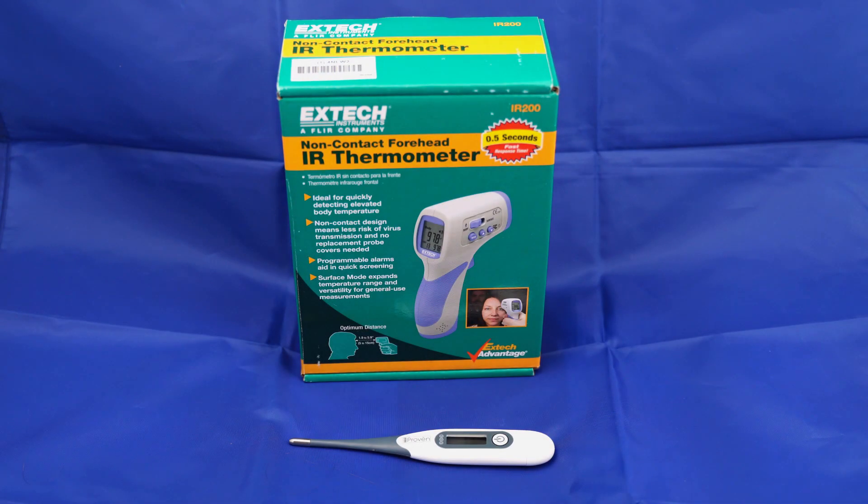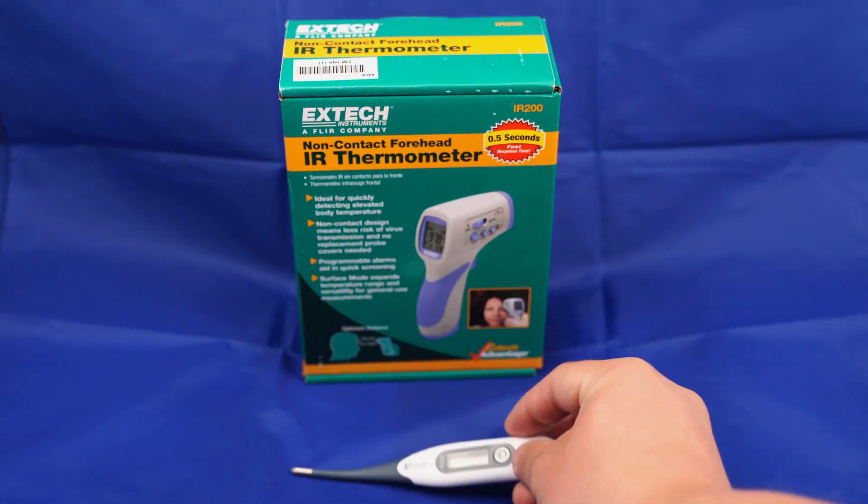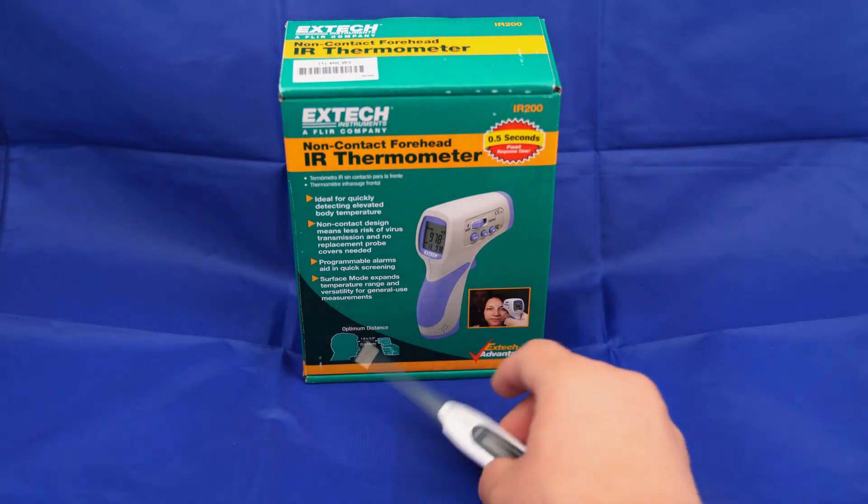Today I'm going to show the initial setup of the XTEC IR200, the non-contact forehead IR thermometer, as well as a calibration to a known heat source. I will be using a thermometer here to get my known heat source and calibrating it to the IR200.